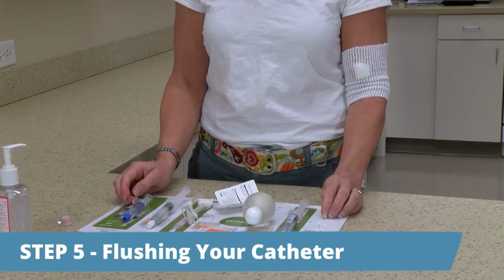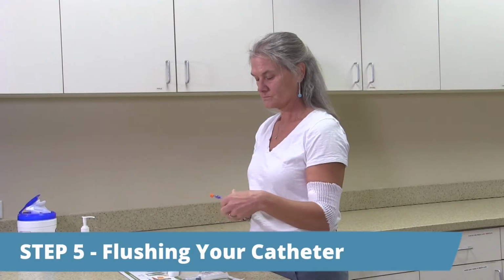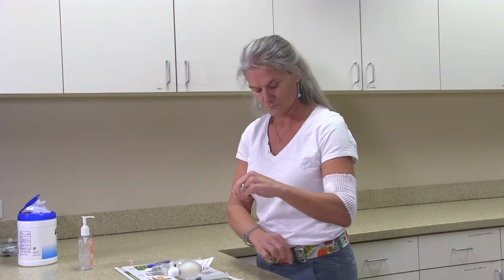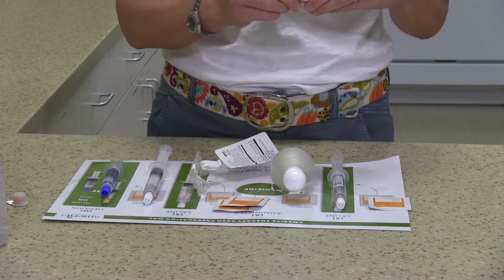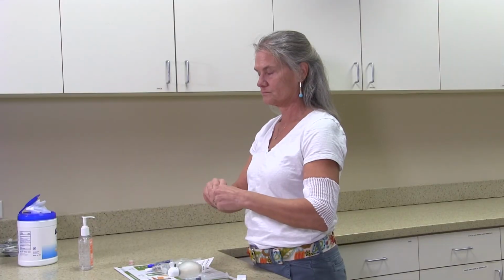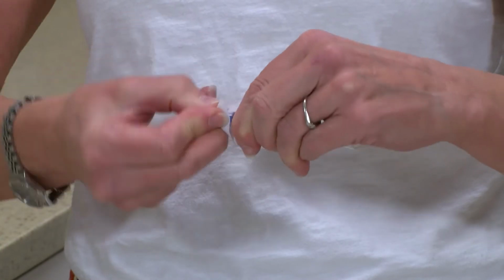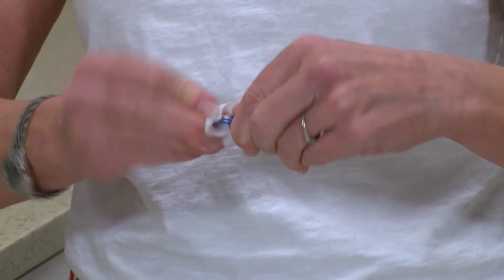Step 5, flushing your catheter. It's now time to flush your catheter. If there is a swab cap on your injection cap, remove it and throw it away. Then, open an antiseptic pad and clean the end of your injection cap vigorously for at least 15 seconds. For purposes of this video, we may not be demonstrating the full 15 seconds.